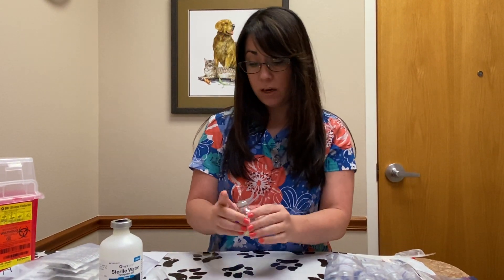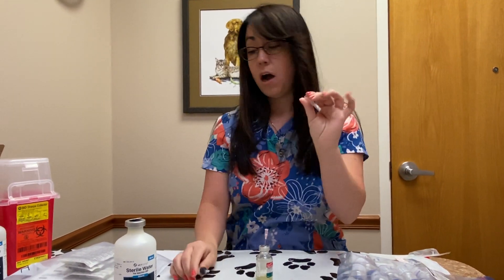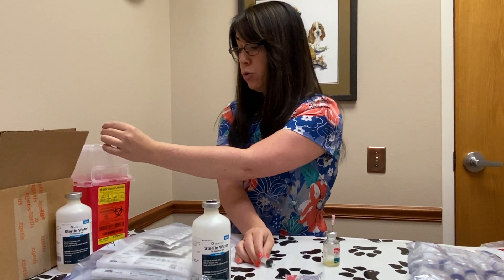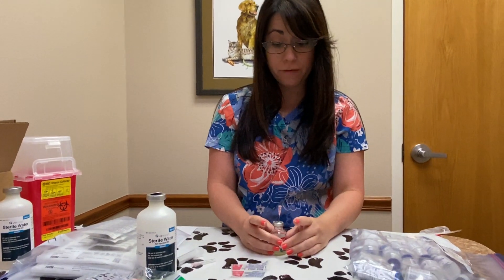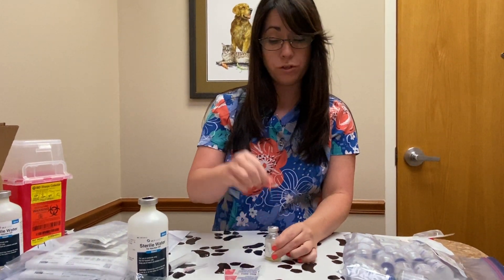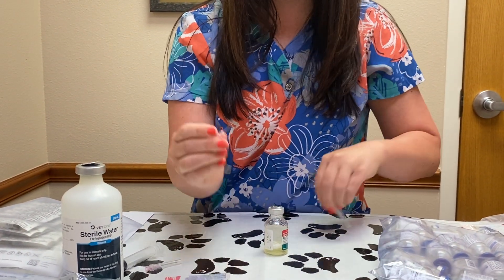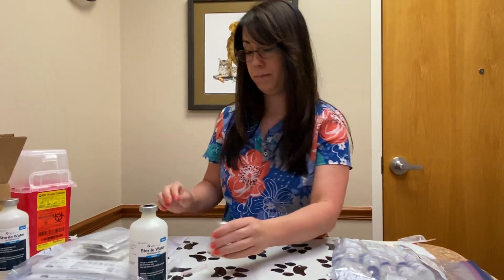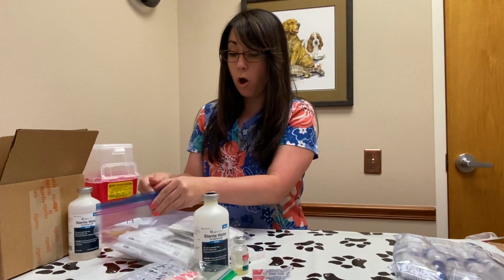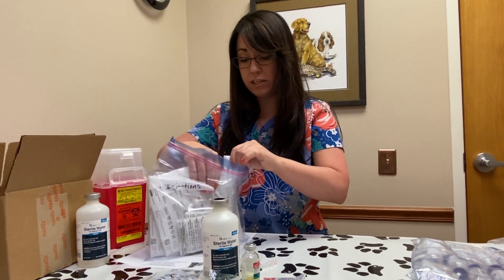When you dispose of the needle, when you're done giving the injection, make sure that you just twist off the needle and put it into the sharps container. When you're actually ready to give the injection, pull out your venting needle and use your single-handed capping method to make sure that you safely cap it. You can hold on to this because you can vent with it again.